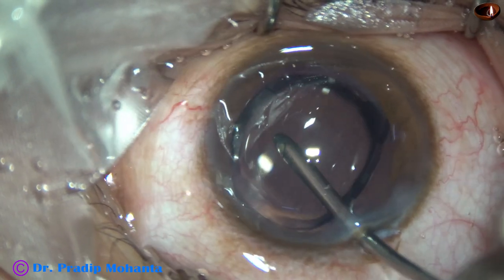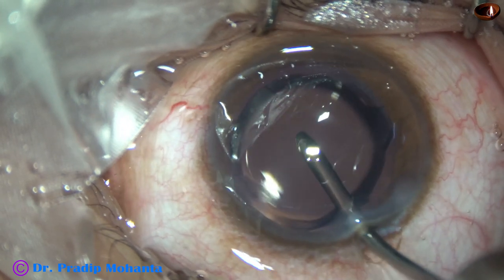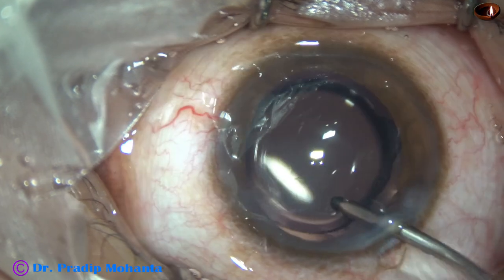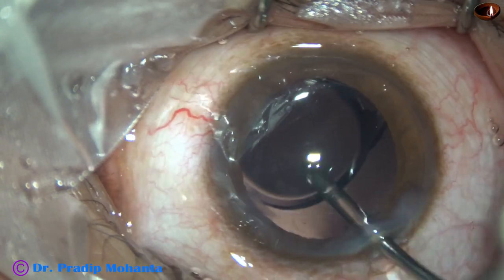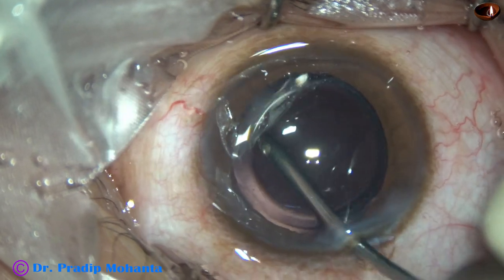This is irrigation of the anterior chamber. There is some amount of viscoelastic in the lumen of the cartridge. If we place the irrigation in the anterior chamber for a few seconds, the visco comes out. I irrigated the capsular bag also.